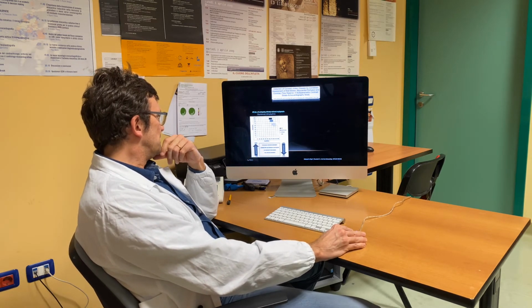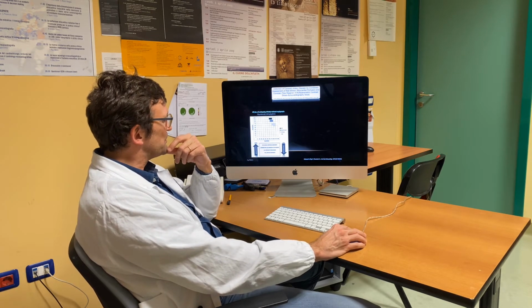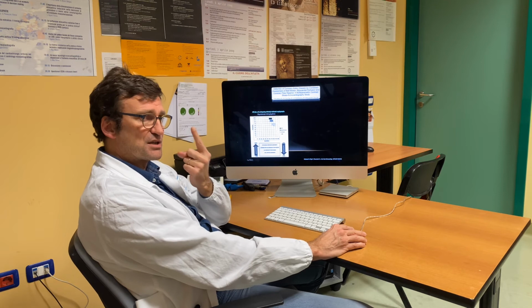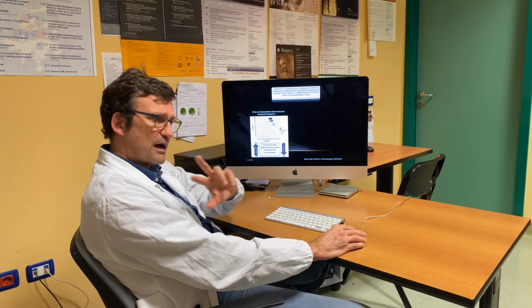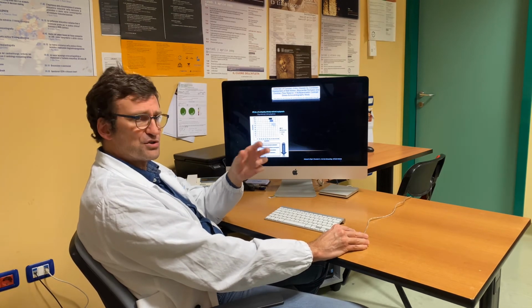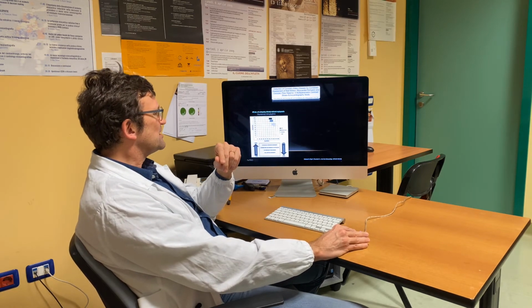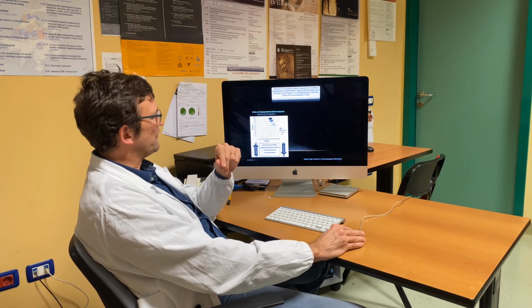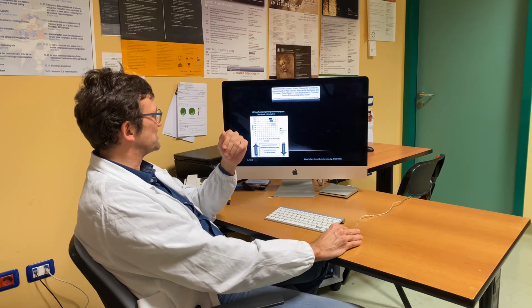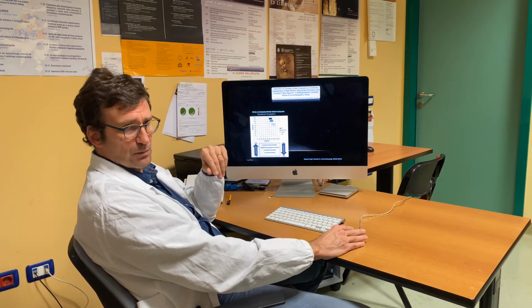And then you have the CFR, which brings your specificity a little bit lower, but the sensitivity a little bit higher. And just consider that you are assessing only one coronary artery, but the results are on the 3 coronary arteries. So it's so potent, CFR, that it's comparable to wall motion, which assesses the 3 territories, whereas with the CFR, only 1. When you add CFR on top of wall motion, you have this very good step up, which is significant, and you have specificity which is not perfect, but sensitivity is more than 80%. And if you use perfusion, you have the highest possible sensitivity.